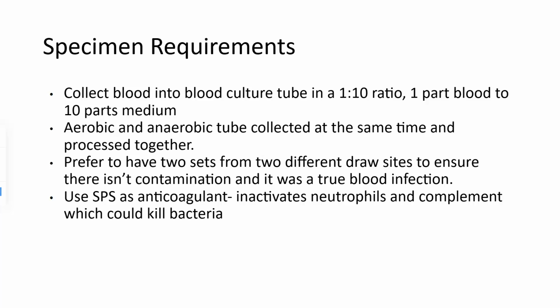So we want to make sure that if we get a positive blood culture, it's for sure a patient has sepsis, because we don't want to report something and cause mass panic and an emergency situation if that's not true, if it was just due to contamination. So that's kind of why we want the two sets from two different draw sites.